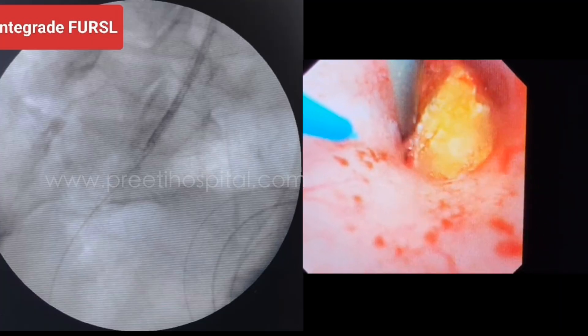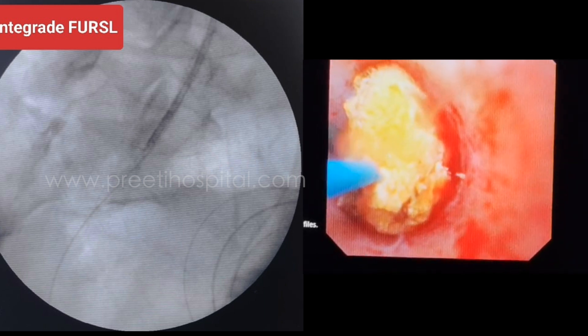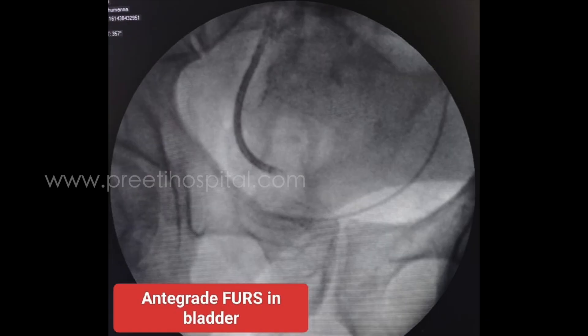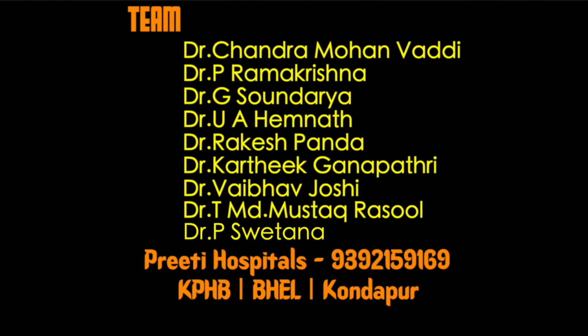A stone fragment was found at the S2 level and lithotripsy was done. The stones were pushed into the bladder and the entire tract was cleared. Finally, a JJ stent and nephrostomy were placed. Due to pneumatic lithotripsy, the stone had retropulsed into the lower ureter, which could not be seen initially with the semi-rigid nephroscope anterograde or the semi-rigid ureteroscope retrograde. Anterograde flexible ureteroscopy helped us clear the stones.